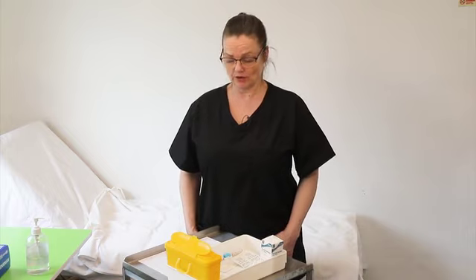And you will often give the injection into the abdomen in an adult. I think we're quite used to that, probably everybody, or the leg. In the OSCE, they may ask for you to administer it in the arm, because the mannequin has injectable ports in the arm usually and in the leg. So that's in the upper thigh, obviously. If you're going to give it in the upper thigh, that's fine, if the mannequin has that injection point. If they don't have that injection point, it can be in the upper arm.